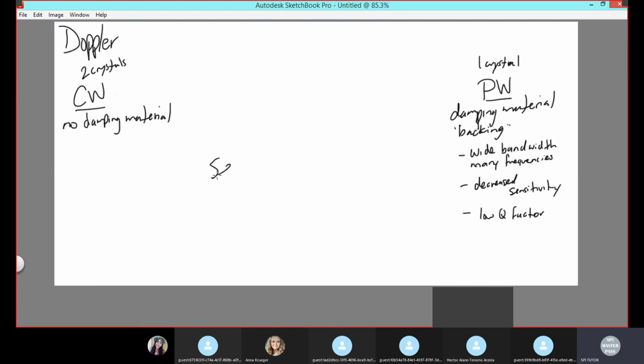Decrease sensitivity. Sensitivity is a big concept in ultrasound. There are two definitions for it. There is the gold standard quality assurance definition, which is when you test positive for a disease or a condition. In my review, I have the little table that you should know to get any question right that deals with that. So that's one definition of sensitivity. The other definition, which is the bigger one, the most common one in ultrasound, is how much you see.